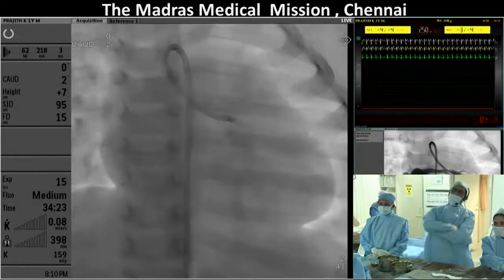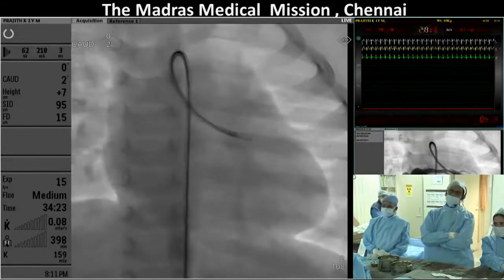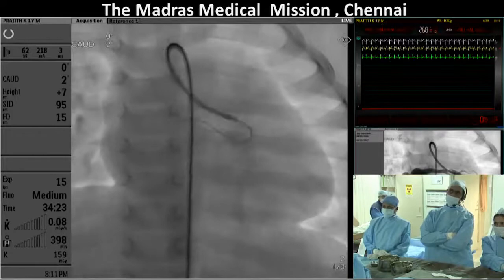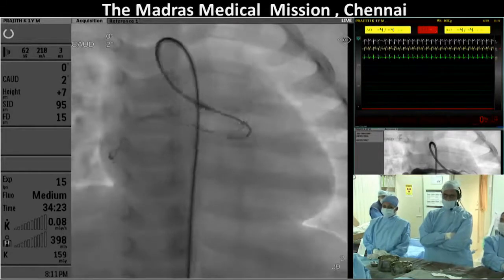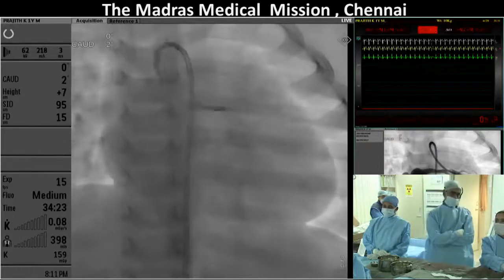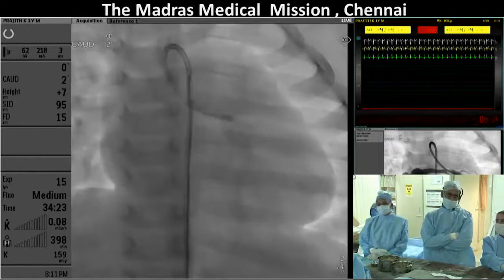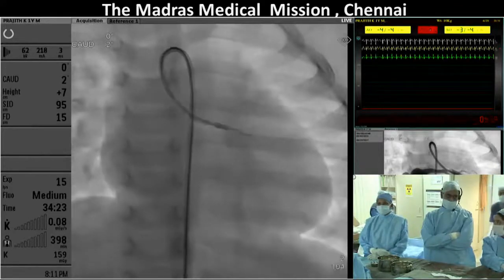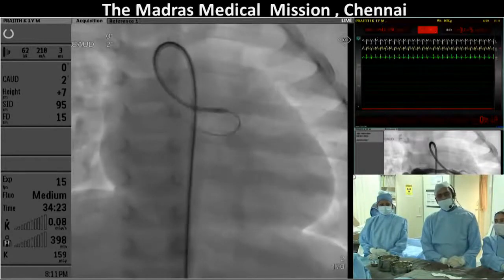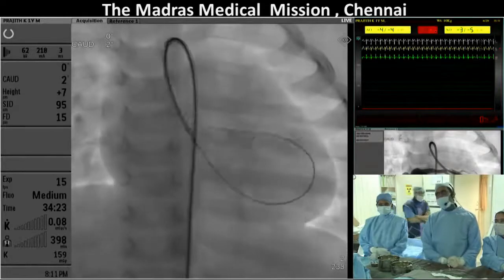So then what we did was we tried a guide wire passage. This is a Terumo guide wire which is coursing across the tunnel. Before you carry on, at the right atrial end, I know on echo you've shown it, but on the angio, there's a suspicion of 2 exit points. Is there just 1 or 2? There are 2 exits even on the echocardiography. There was one sort of superior exit and one inferior exit. Okay, I missed that.